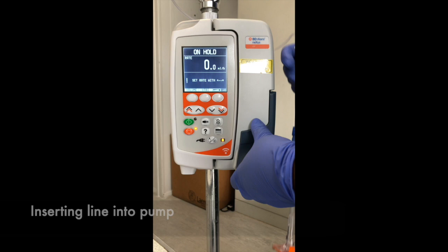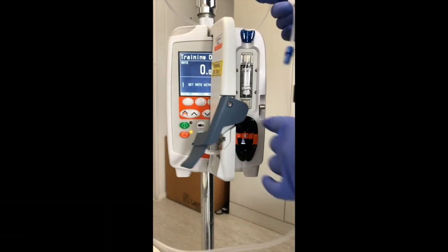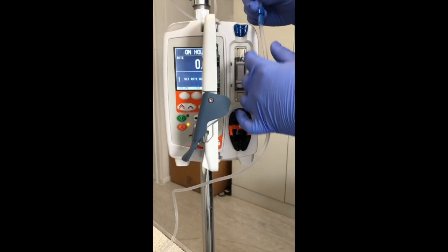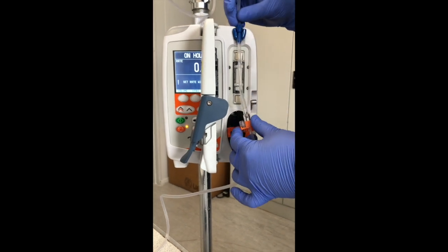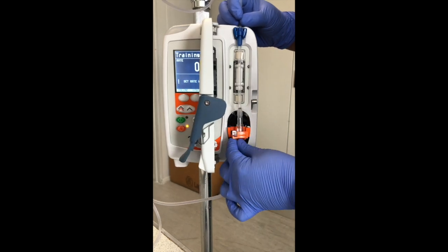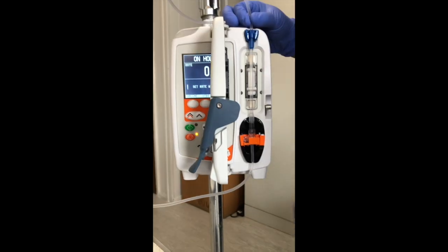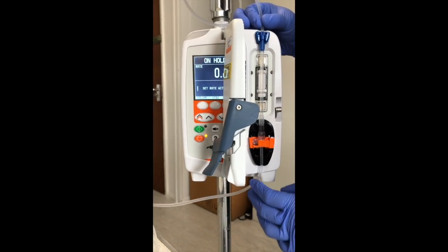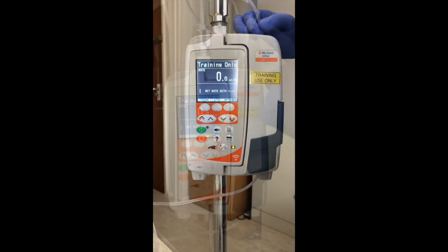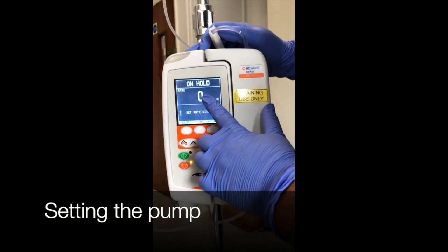To insert the line into the pump, open the door by pulling on this gray lever. And blue to blue, orange to orange. Do not stretch the silicone bit because that's what's going to make a peristaltic movement. And then insert the orange bit, clip in, and then ensure you've got either ends going down and not clamped. And then push the lever and close. Once the line has been loaded, open your clamp and you can now set your rate.